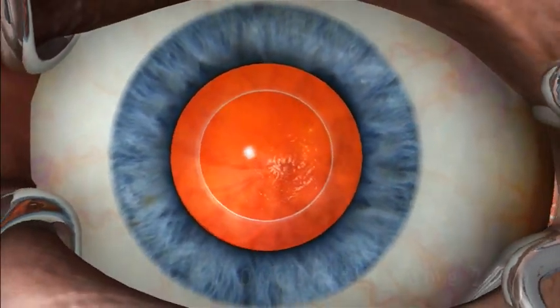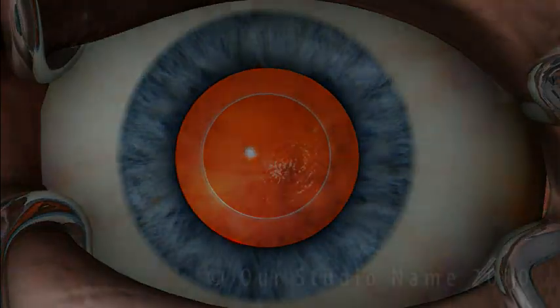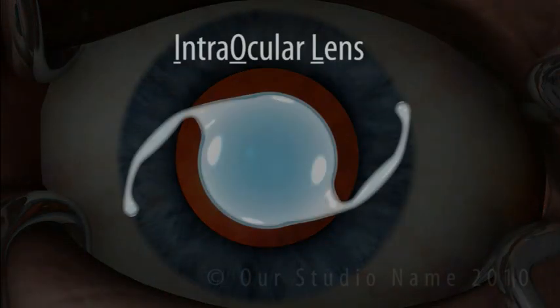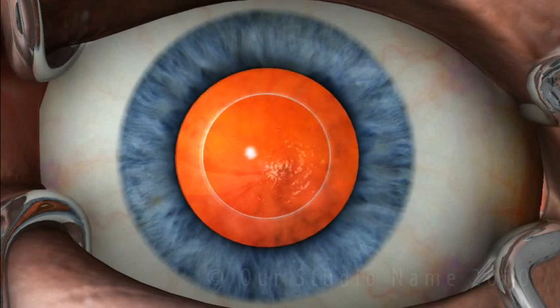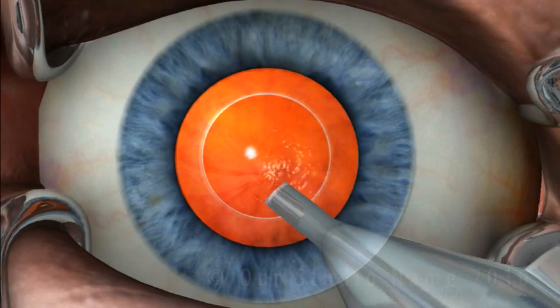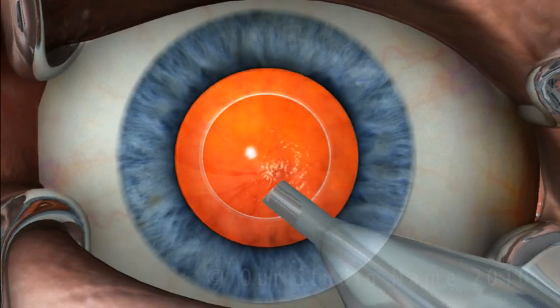Once the cataract is removed, an intraocular lens, or IOL, will be placed into the empty lens capsule. Small struts will hold it in place.